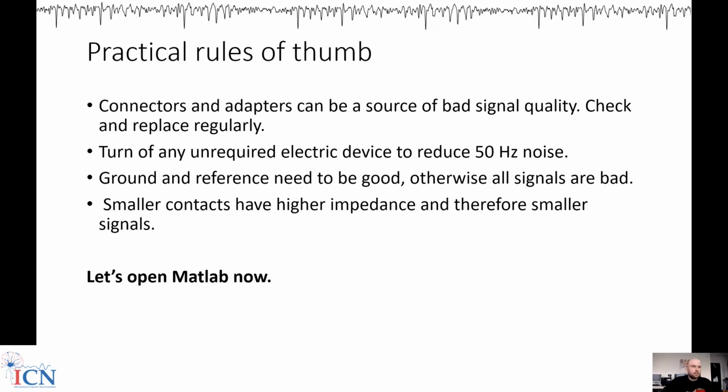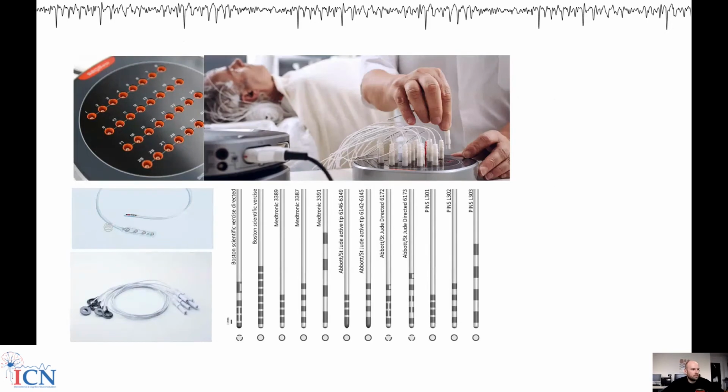Okay, great. Yes. So you have shown us different electrodes, and some of them had those segmented contacts on one level. Intuitively, I would think that due to the higher impedance, the measurements would be more localized. So the question would be, when you measure local field potentials with these electrodes in the STN, do you actually see a more characteristic response of subregions of the STN? For example, if we think about adaptive DBS, would it be better to control the stimulation, or is the signal just not enough to characterize?